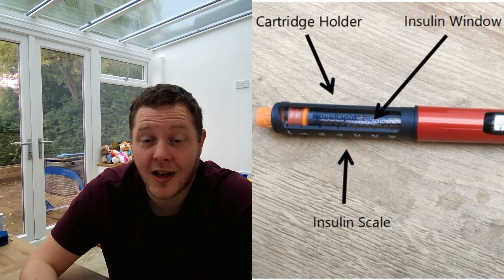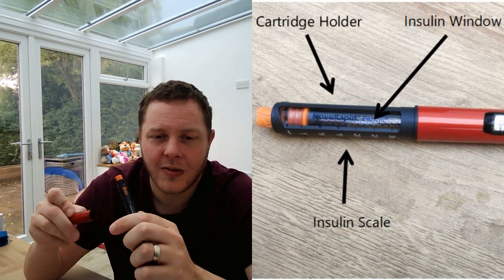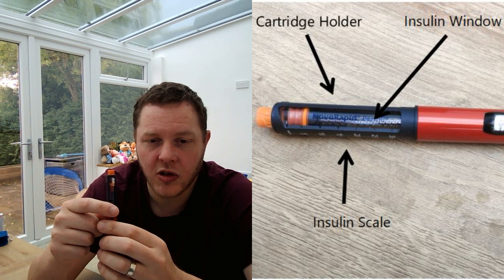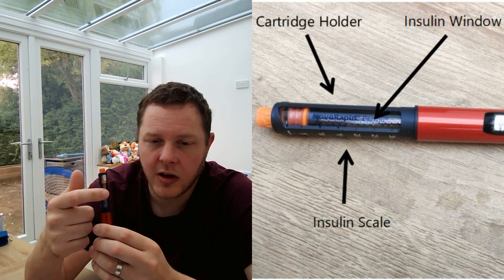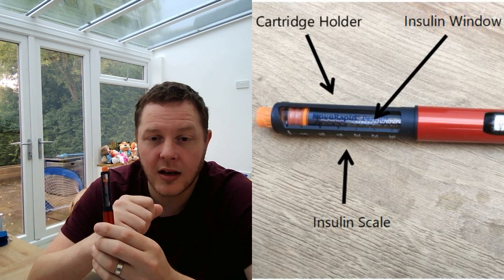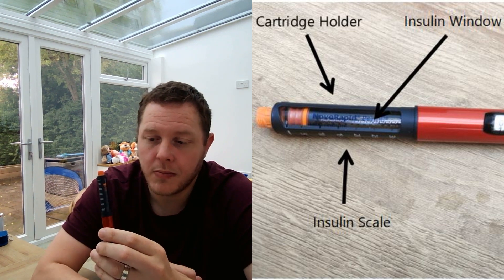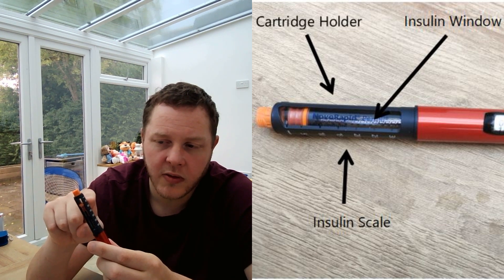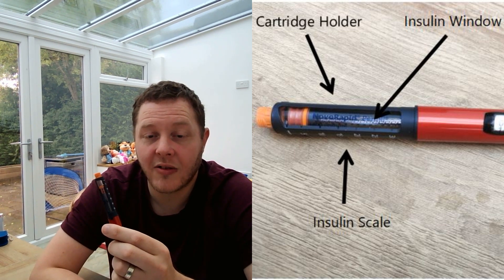Let's get straight into it and look at the Echo Plus. With the pen you've got the pen cap, so you can twist that off, and straight away you can see the cartridge holder that holds the insulin cartridge and connects it to your smart pen. You can also see the insulin window, which is super handy because you are then able to see that you are injecting with the right insulin — and that is so important.